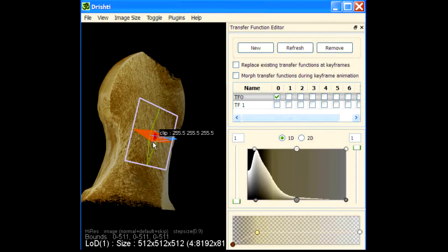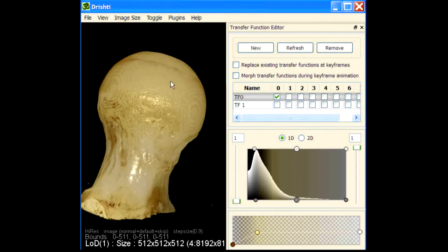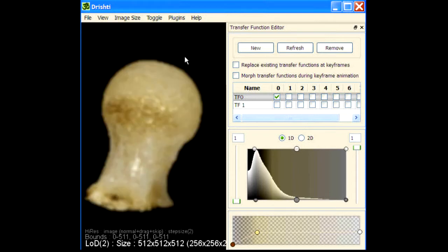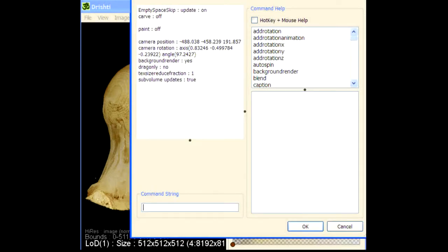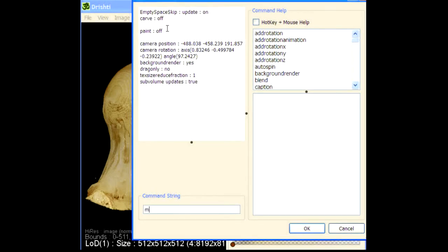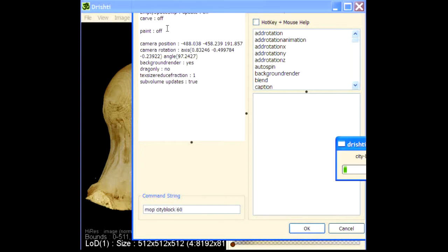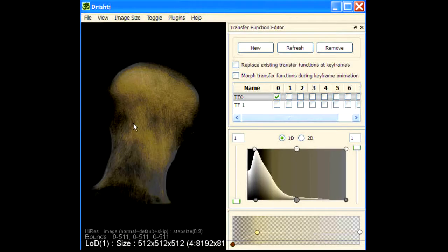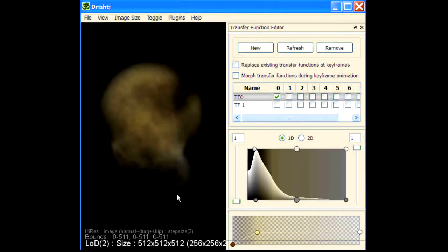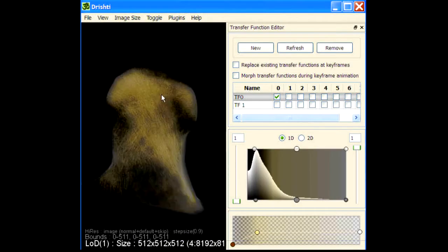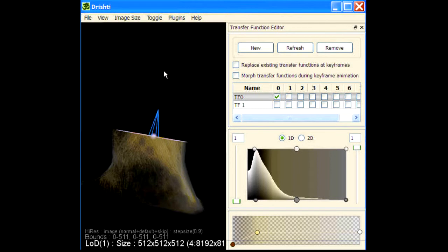What I will do is apply the city block transform. So press spacebar, city block, and do 60 iterations. I'm assuming that my bone is not more than say 60 voxel deep.